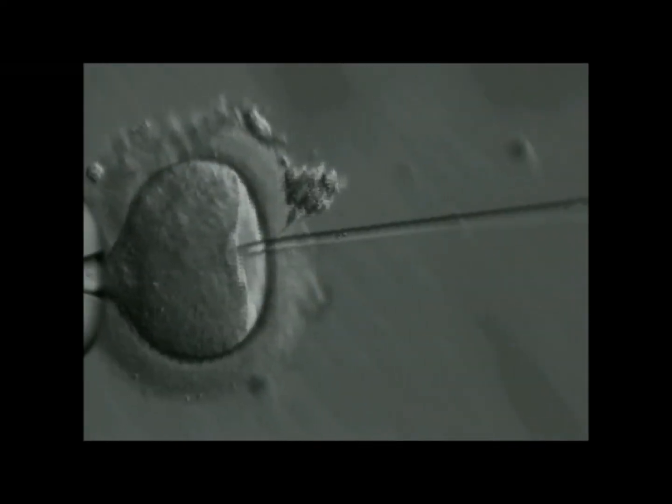Welcome to the Center for Reproductive Medicine and Robotic Surgery. This video demonstrates the high-tech process of ICSI, Intracytoplasmic Sperm Injection.